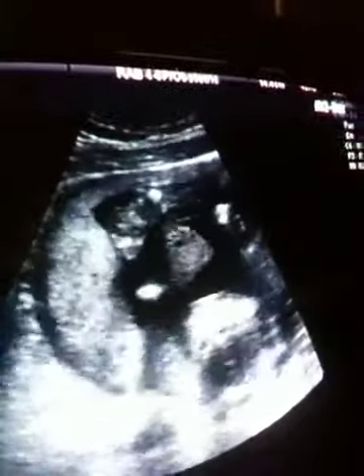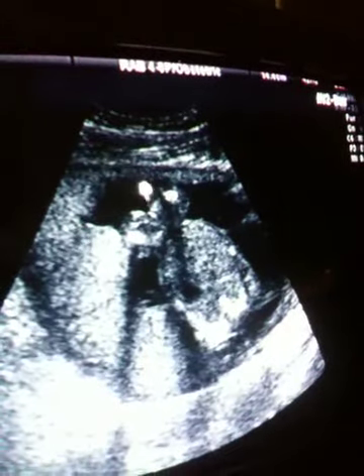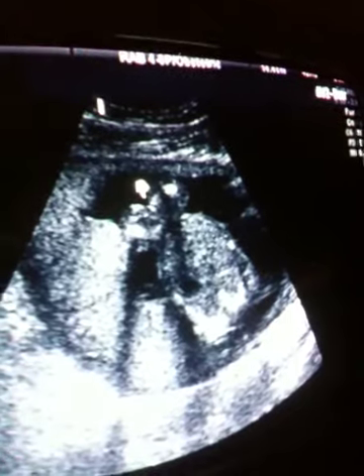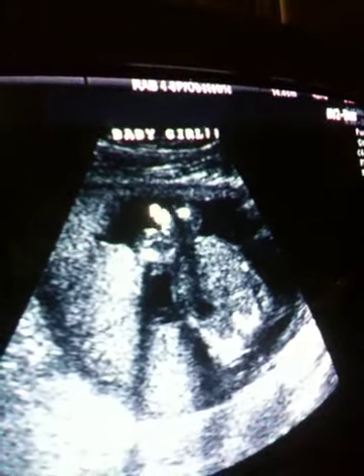He's so awesome. Hey baby, you're certainly moving for me, aren't you, Angel? Right between the legs — little him, little him. I'm looking right in here and there is nothing there, so it definitely is a baby girl. Congratulations. Let me show you again. Those little lines here, that's her little hoo-hoo right there.